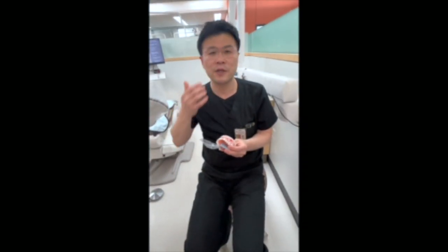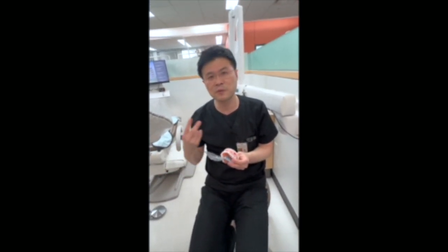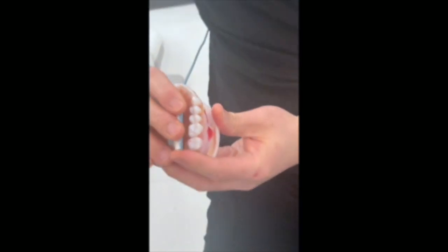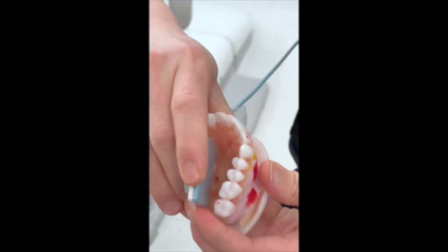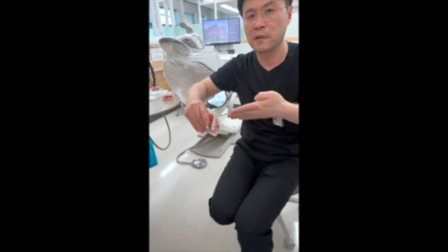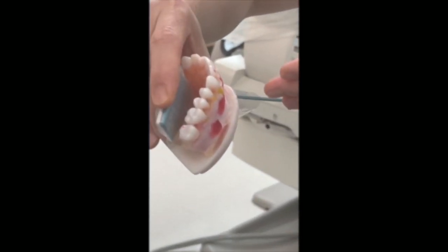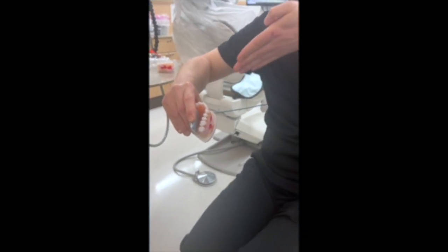Also, we may be in the situation where we need to determine if premolars are single rooted or double rooted. So when you're taking the radiograph with this angulation, it's not necessarily visible with the angle that we're showing. So it's important to take the radiograph at an off angle where we shift the x-ray tube mesially in this situation.